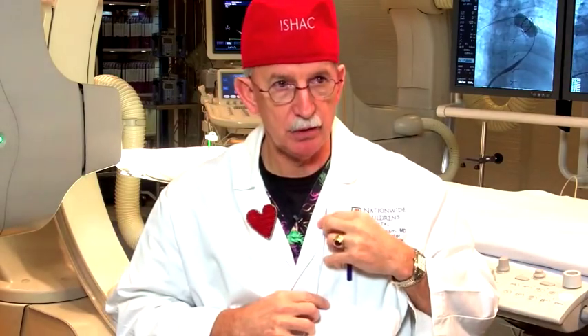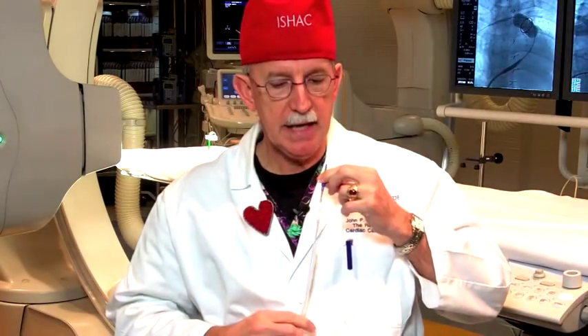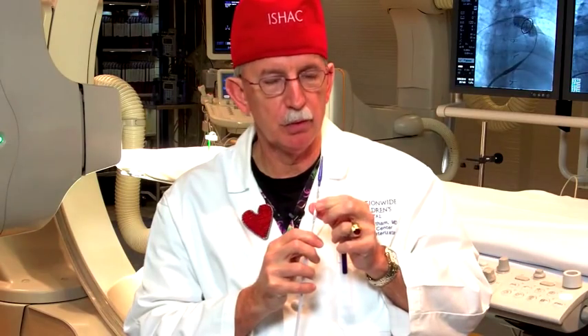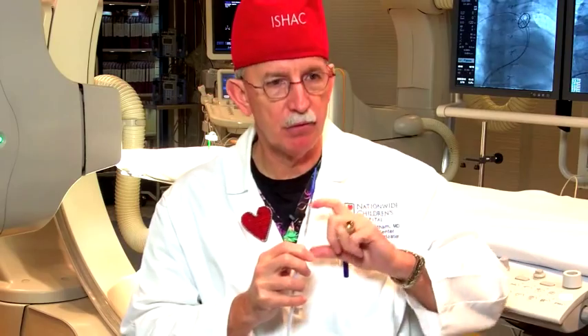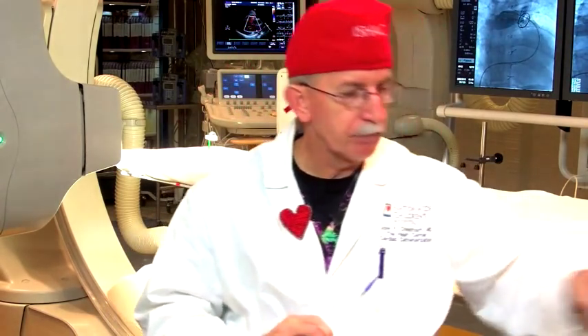With this catheter, we introduce it through a vein in the leg over a wire and get it into position inside the surgical conduit with the valve. Once it's in position, we expose the valve. This balloon — which actually has two balloons — will inflate: the first balloon blows up halfway and takes the valve up halfway, then the second balloon expands the stent and the valve all the way so it fits inside the degenerating surgical graft. Once we take the balloon down and remove the catheter, the valve inside the stent immediately starts to open and close.